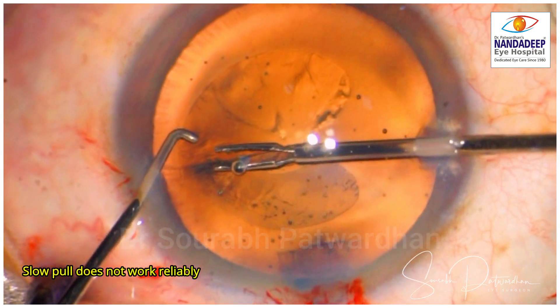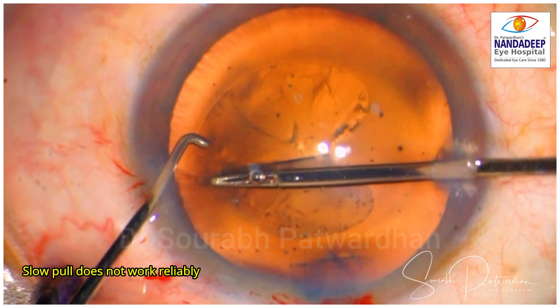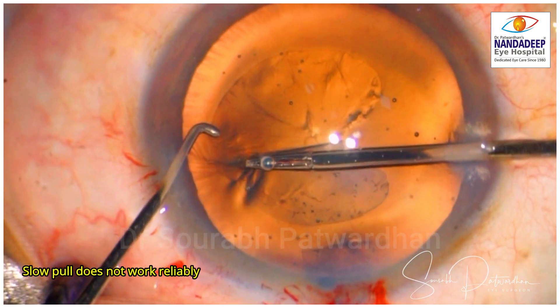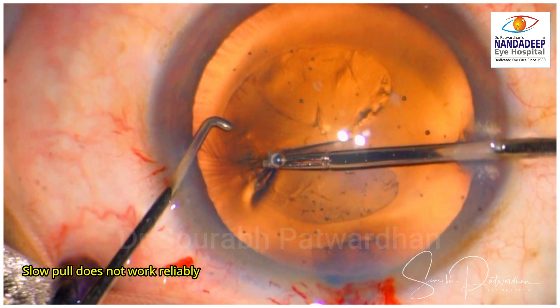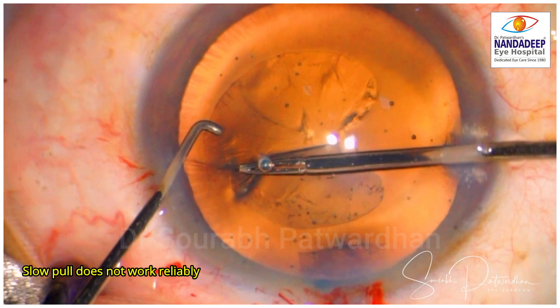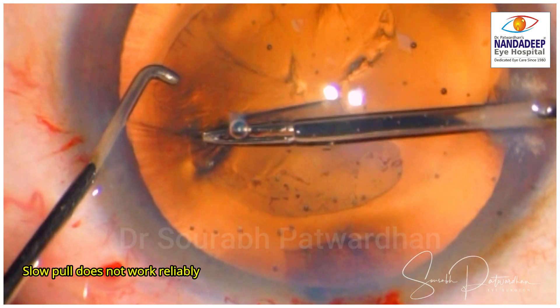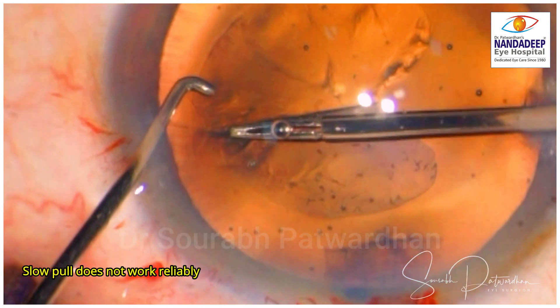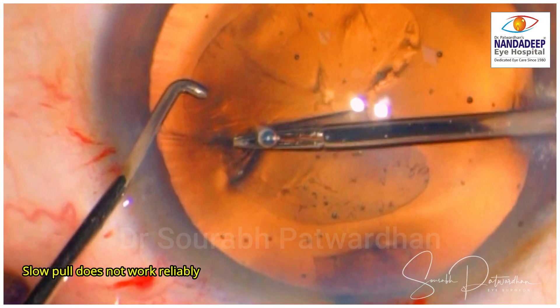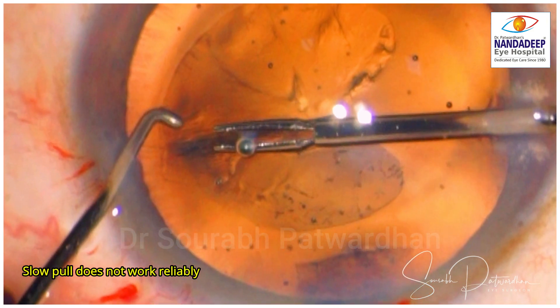Now the pull — the direction of the pull is correct here where the trainee is pulling it centrally, but he is too slow. The trainee is hesitant because he feels that the capsulorhexis will go even further out into the zonules and periphery, but here you have to be quicker. You can see in this video that if you keep pulling it slowly, in fact the capsulorhexis is going to go out.